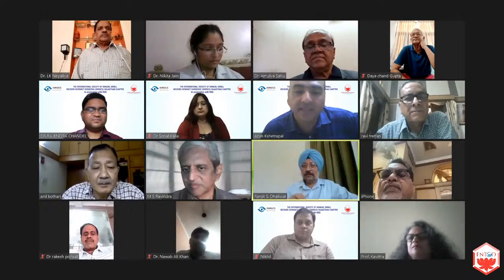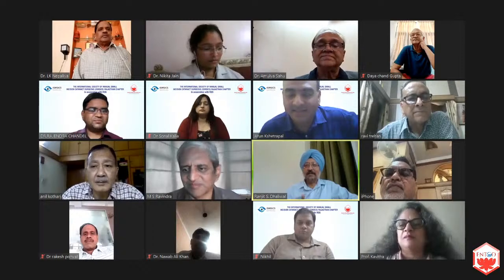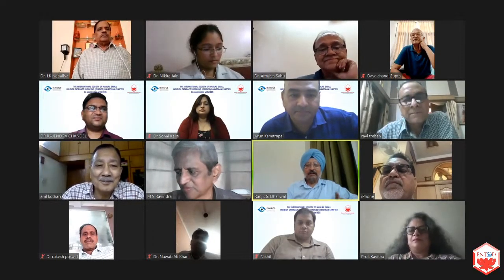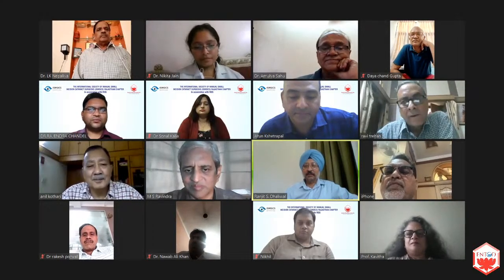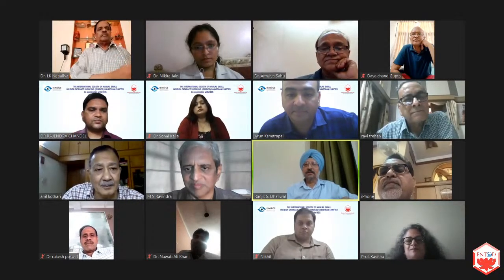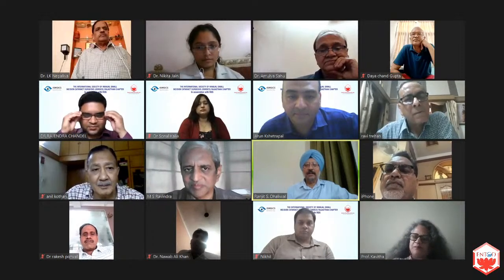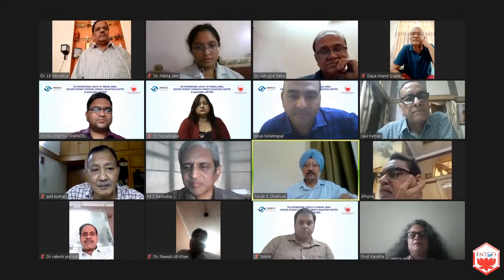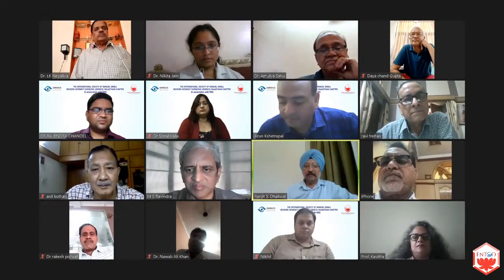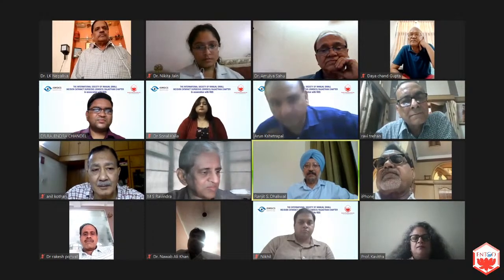Yes. I want to make, in just half a minute, 5 points which are covering all this. And I'm addressing only the residents now, none of the consultants. To stabilize the eye, nobody has talked about a cotton bud. I've been using just a cotton bud throughout. Very rarely I was holding it, and never hold the upper lip of the tunnel, one thing. The second is, as you go into the tunnel, we have dissected the sclera and we are entering the corneal zone.